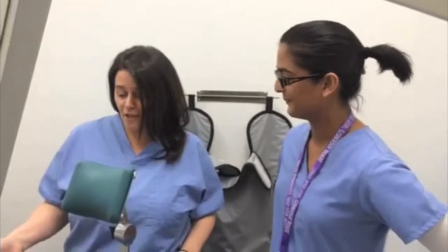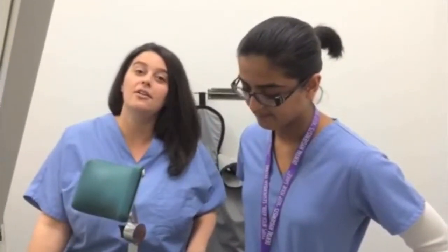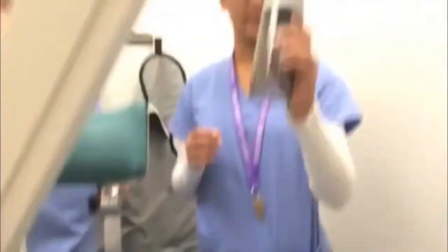And now we're doing our first series of film, traditional D-speed film, and we're using a rectangular collimator. Okay, so we're doing our second series now. We removed our rectangular collimator, and we're just using a round collimator, and this will increase the X-ray beam size. We just removed the round collimator. This is our last exposure. This is just going to show us the difference between round, rectangle, and having no collimator at all.